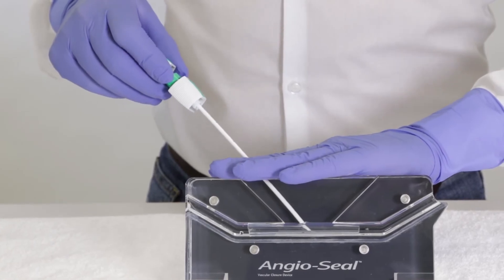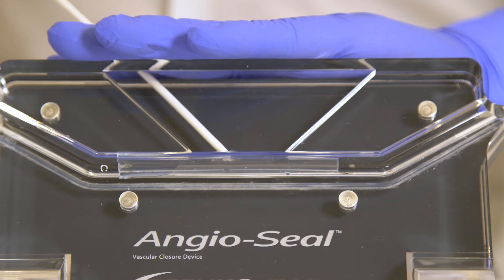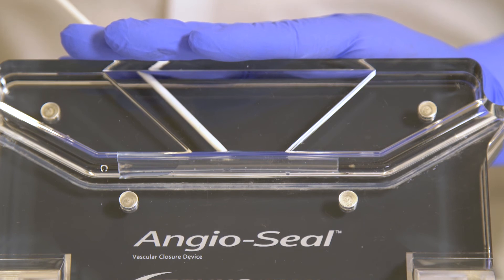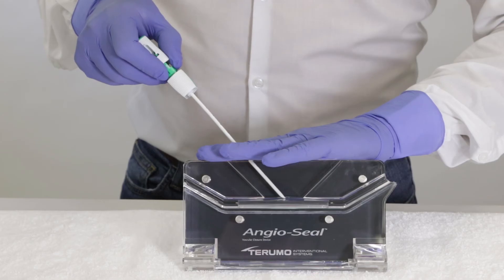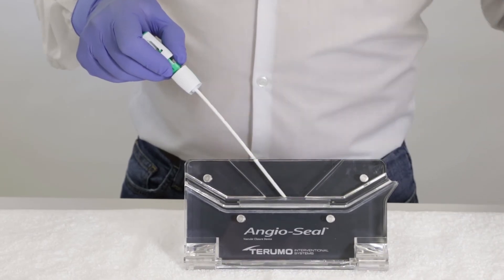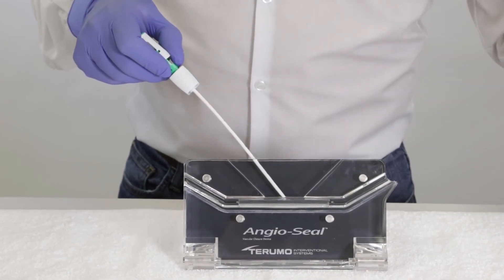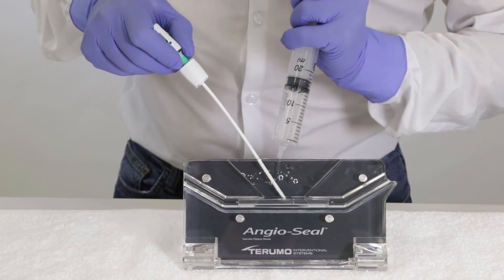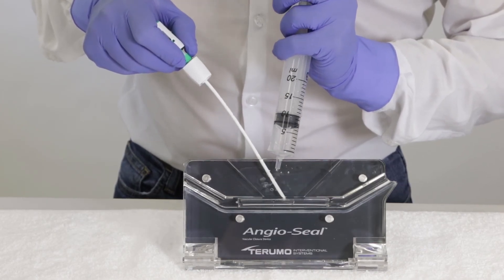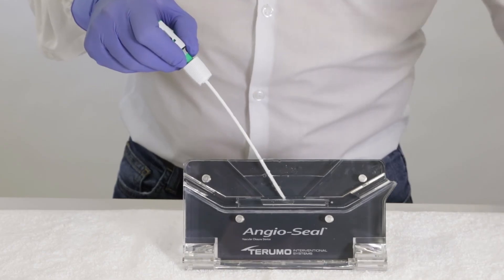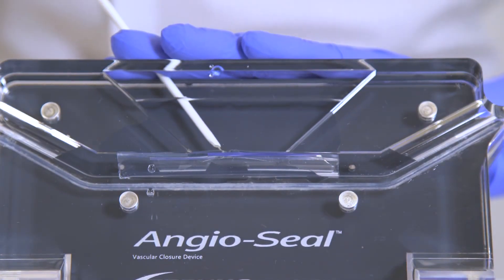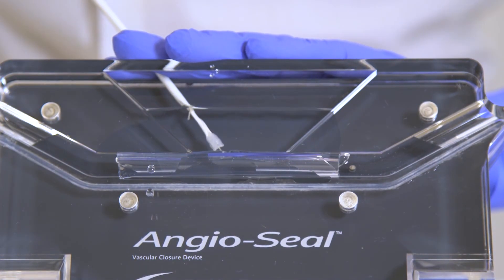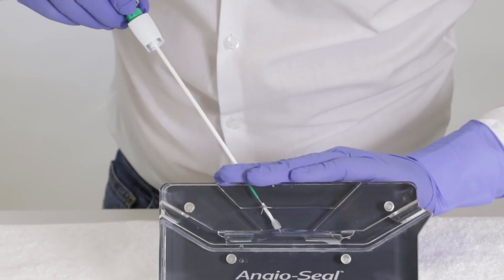With your right hand pull the cap of the device at a 45 degree angle. You will feel some resistance as the anchor is at the other side of the arteriotomy. Now I add a little water and pull the device back. You will feel some resistance because the anchor is pulled against the inner artery wall.